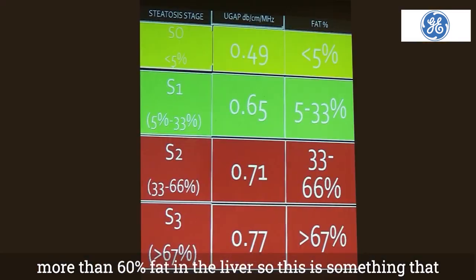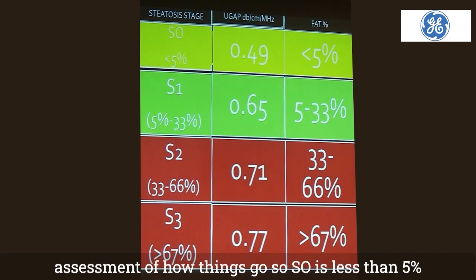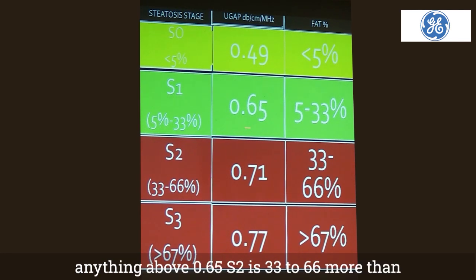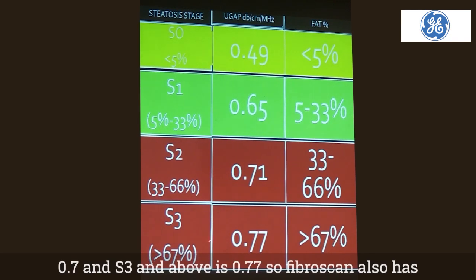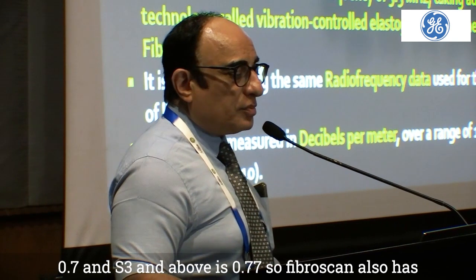This is something that I have made on the basis of my last 1 year's assessment of how things go. S0 is less than 5% fat and the value is 0.49. S1 is 5 to 33%, anything above 0.65. S2 is 33 to 66%, more than 0.7, and S3 and above is 0.77.